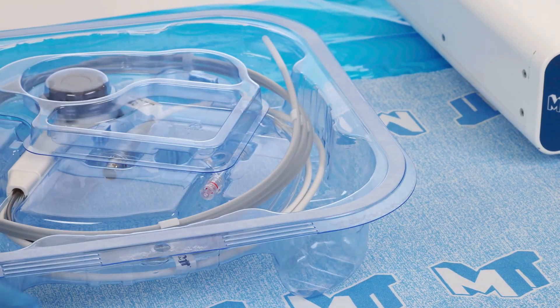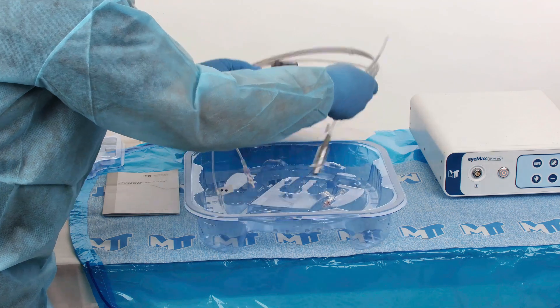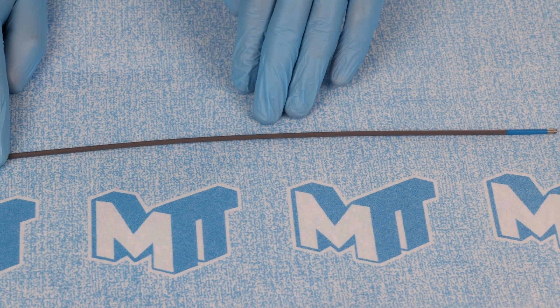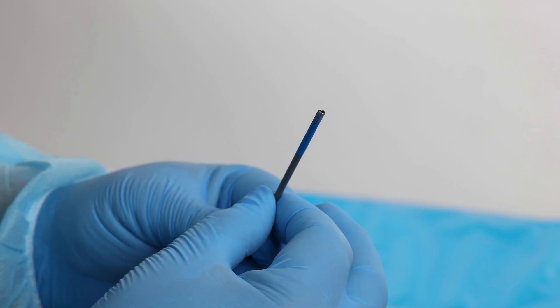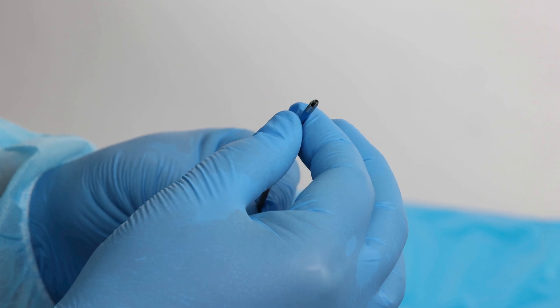Remove the eyeMax scope from the sterile package and check for any damage. Visually inspect the entire surface of the insertion portion. Then visually inspect the distal tip of the insertion portion of the scope for damage, including dents, prominences, cracks, or holes.